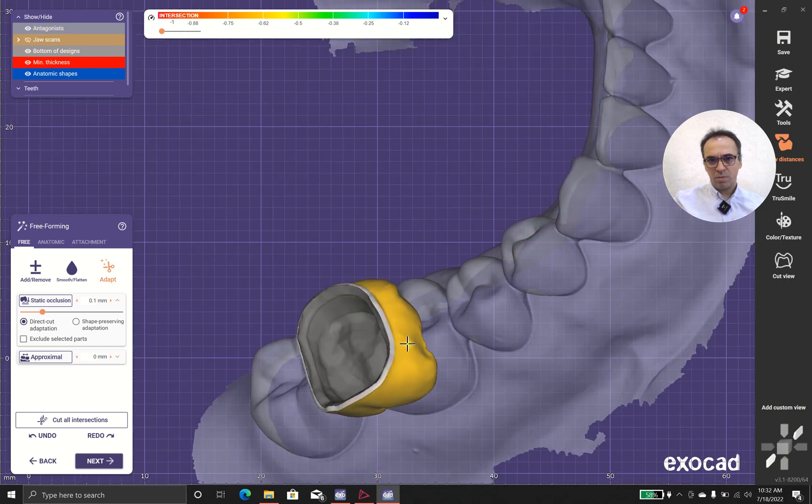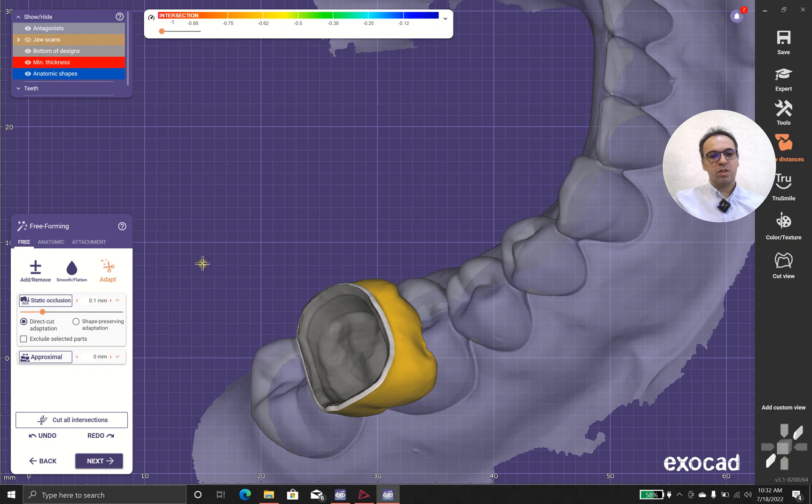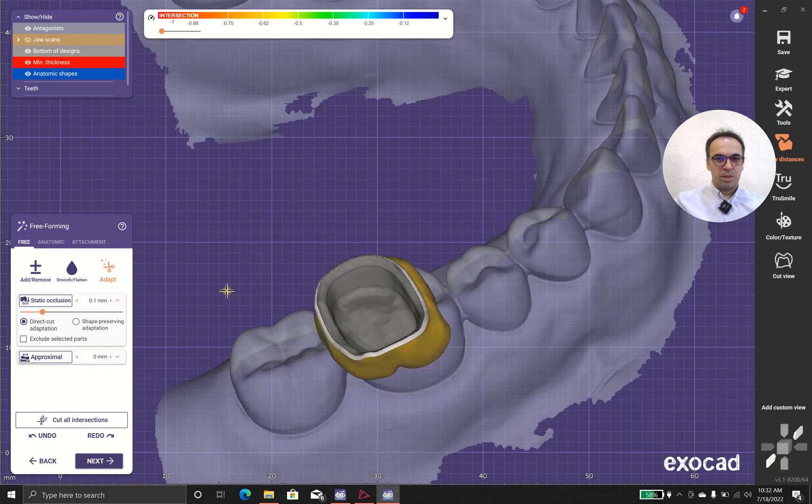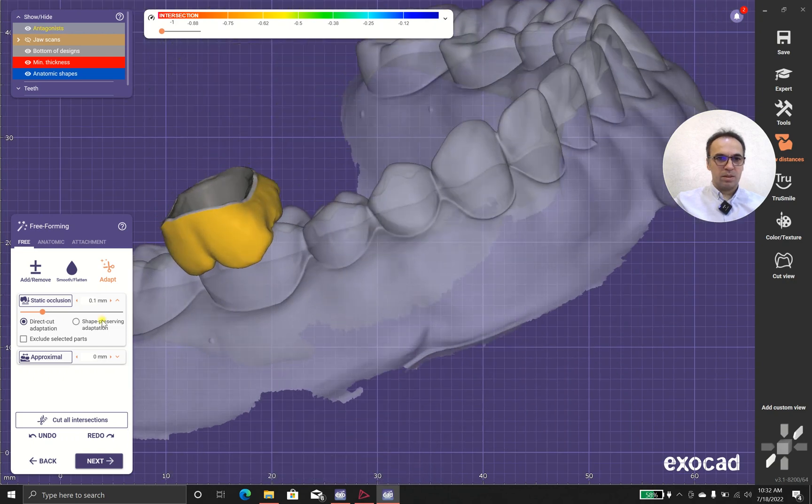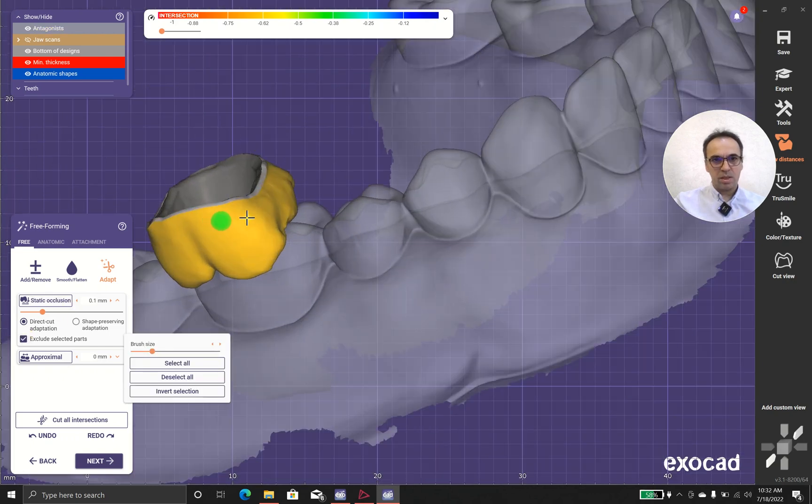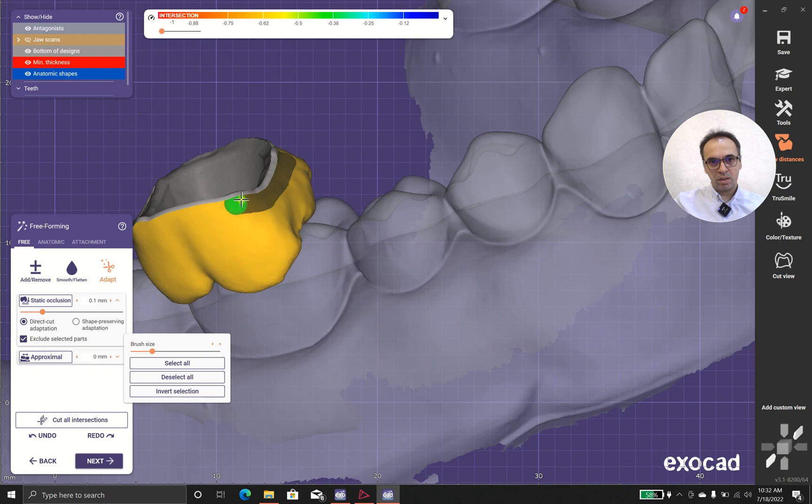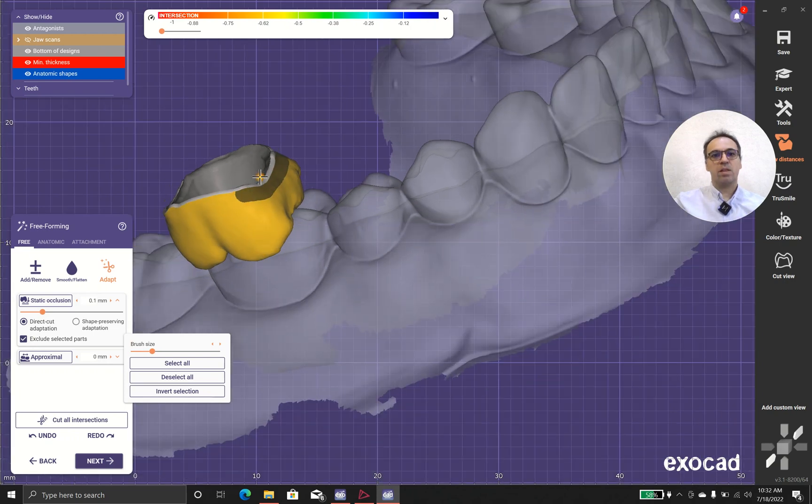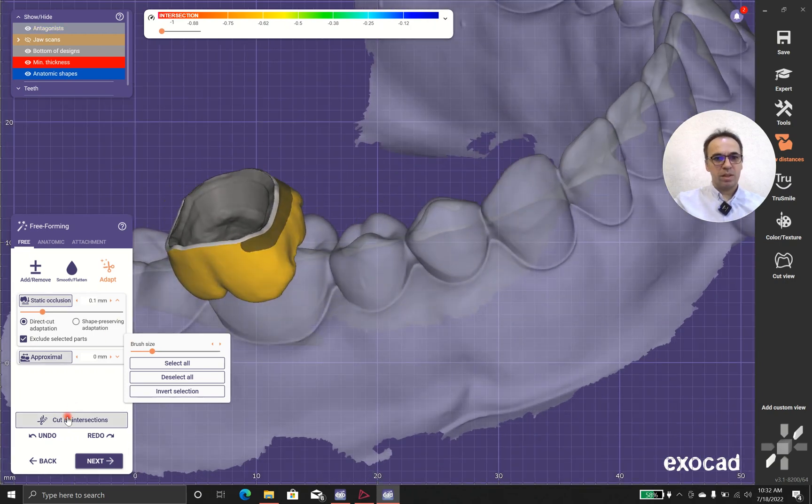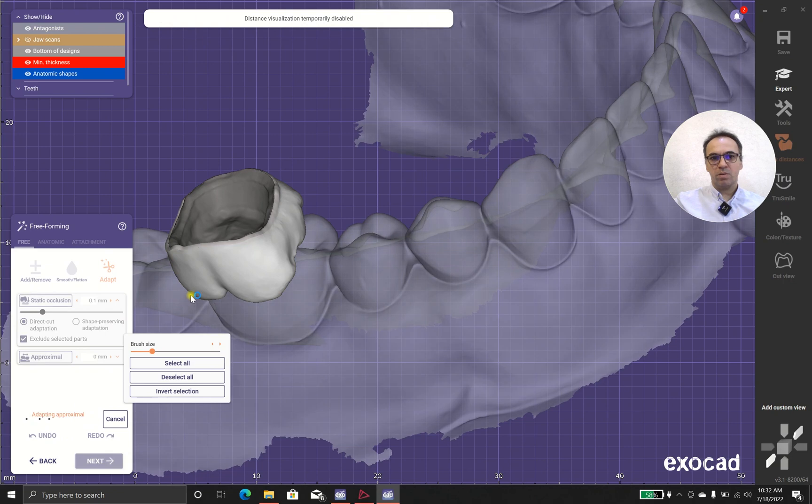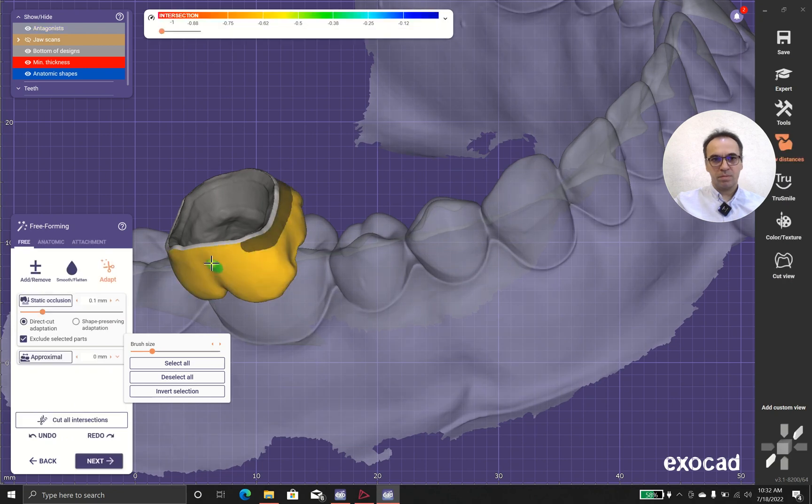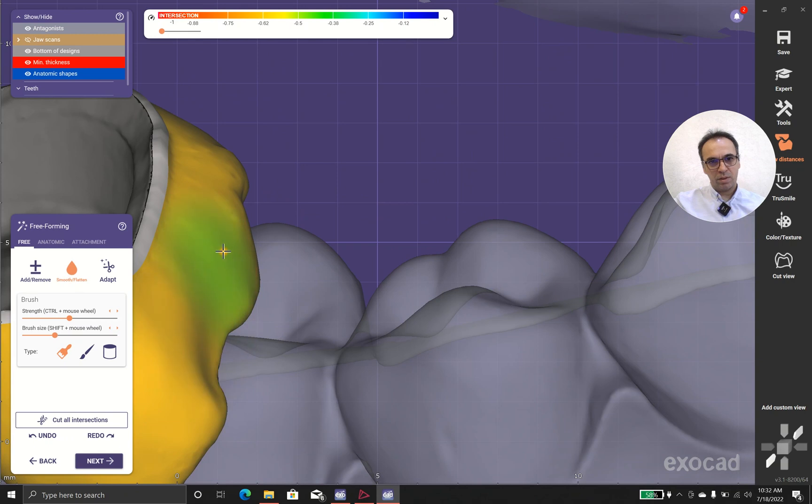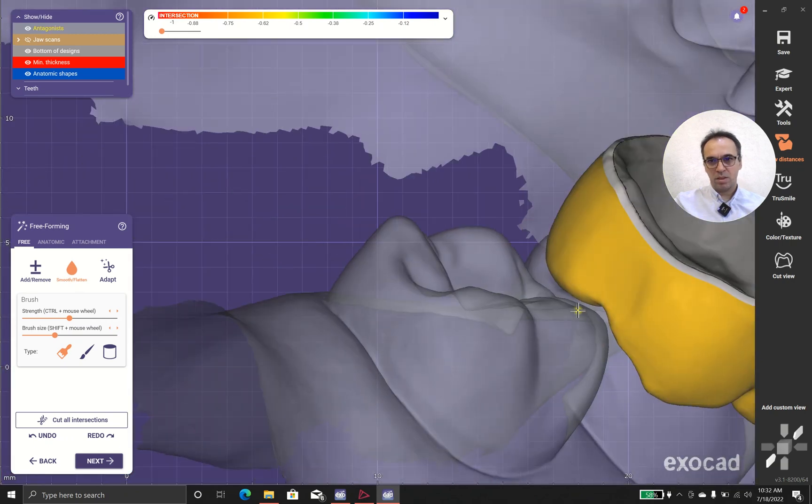Sometimes we have problem with gingiva over here and the gingiva doesn't let us to cut it properly. But in that case you can use this as exclude and it says, okay software, don't do anything with this part. And after that you can do the cut.